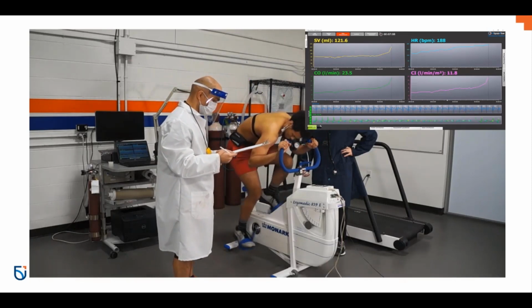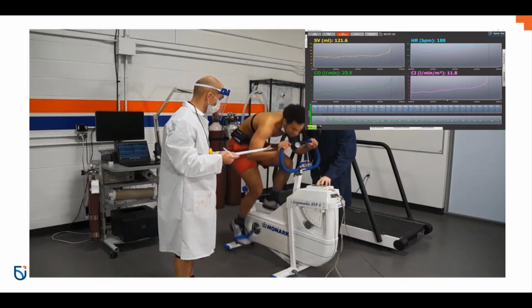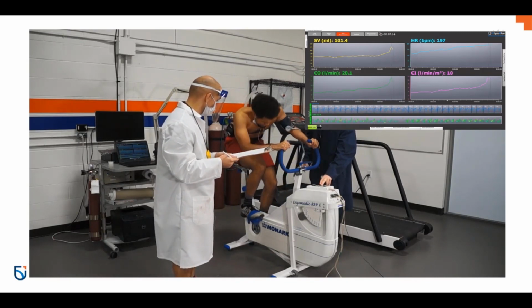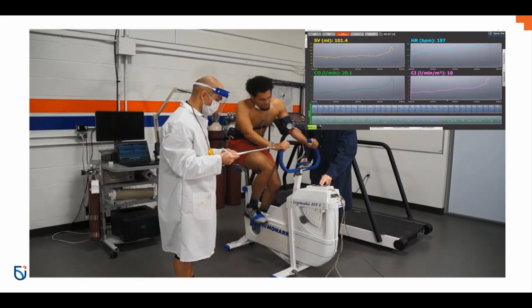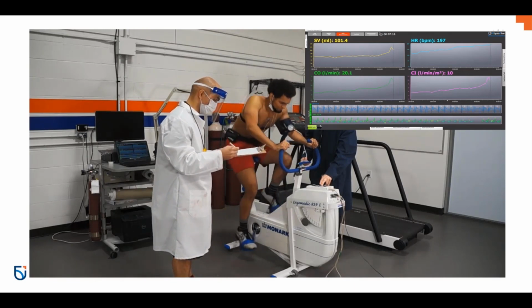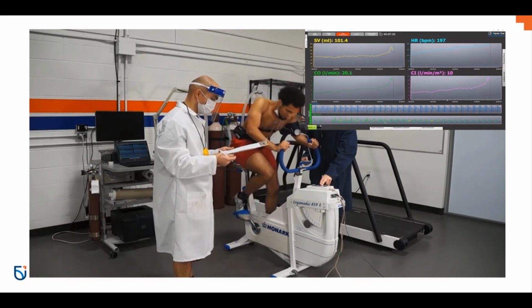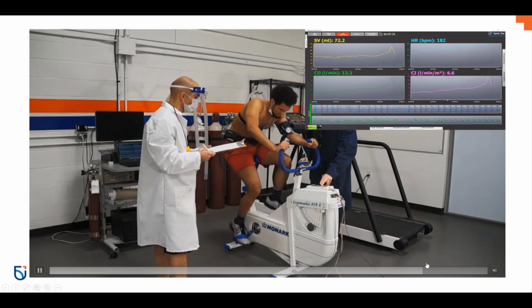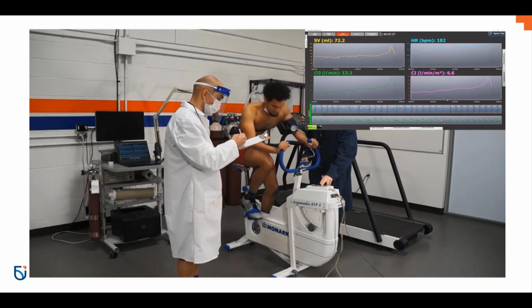Again, I didn't choose a super easy test. I didn't want to go long. I didn't quite think that it would be that quick, or I probably would have tried to slow the progression of the stages down, probably to about 30 watts per stage. This is a little bit quicker than I thought, because we're not into the 8 to 12 minute range.